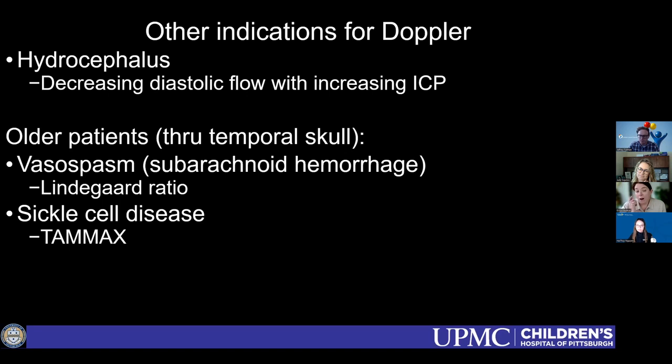And then we are now, our adult neurosurgical team and neurovascular team has us do Lindegaard ratios for all of our pediatric patients with subarachnoid hemorrhage. So we are doing those as well.